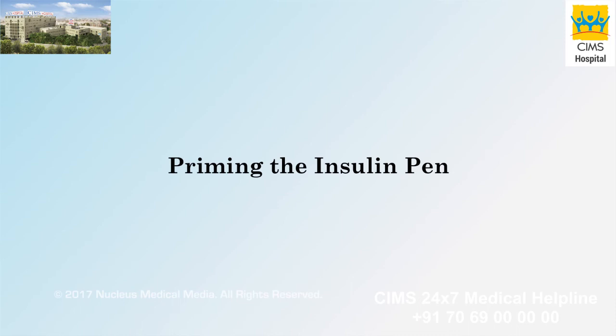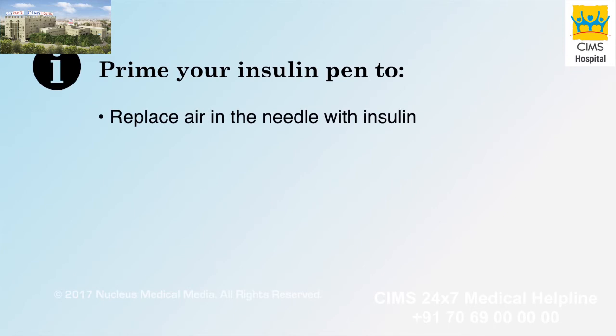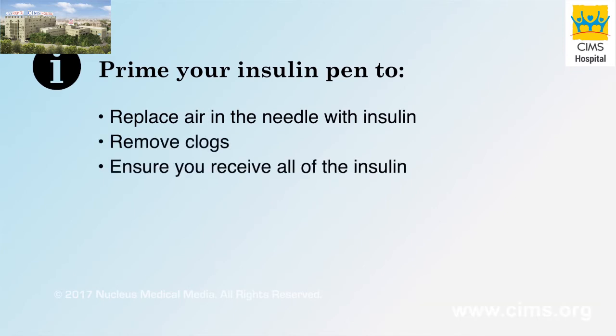Priming the insulin pen. Priming the insulin pen replaces the air in the needle with insulin and removes any clogs or blockages. This ensures that you receive all of the insulin you intend to inject.